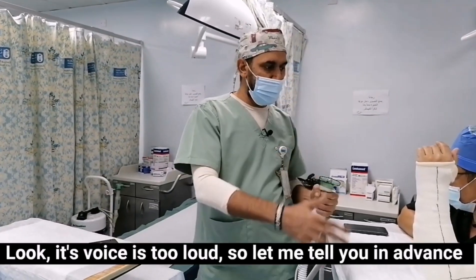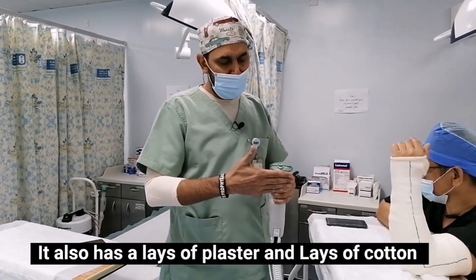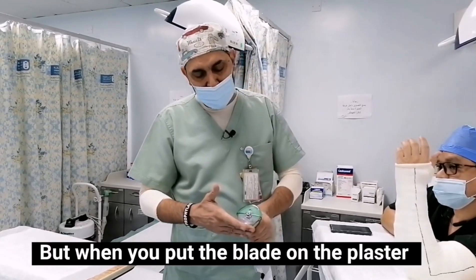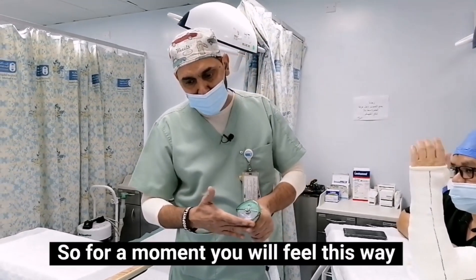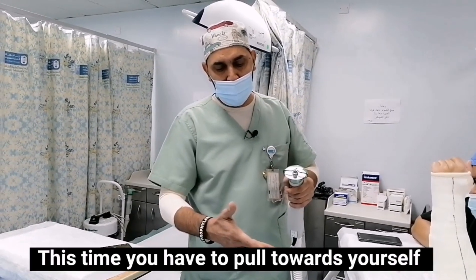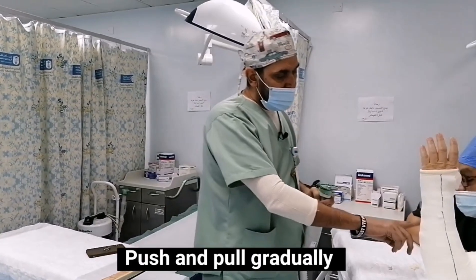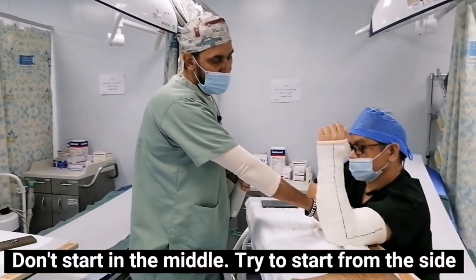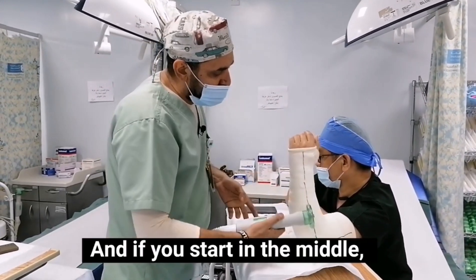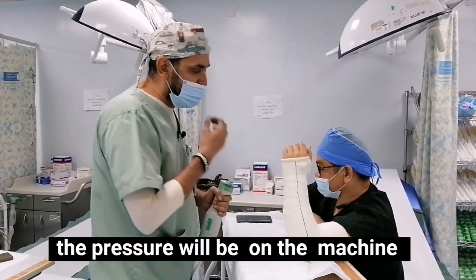Look, its sound is too loud, let me tell you in advance. When you cut the plaster, you will feel the layers of plaster and cotton. When you put the blade on the plaster, for a moment you will feel that the plaster is gone and you are touching the cotton. At this time, you have to pull the blade towards yourself — push and pull gradually. Don't start from the middle; try to start from the side. If you start in the middle, the pressure will be on the machine, which will lead to damaging of the machine. So always remember how to do it.